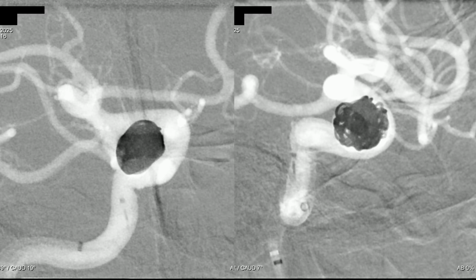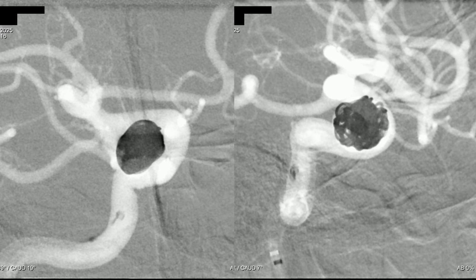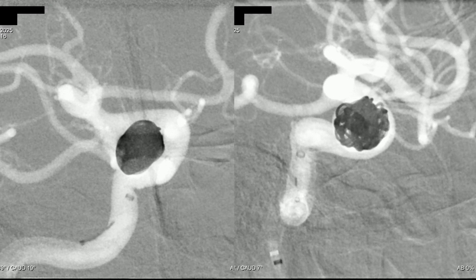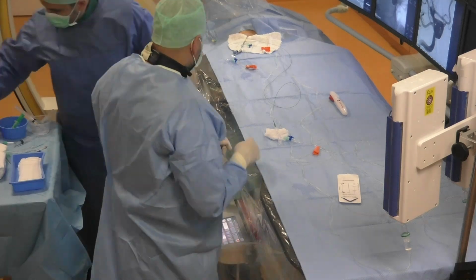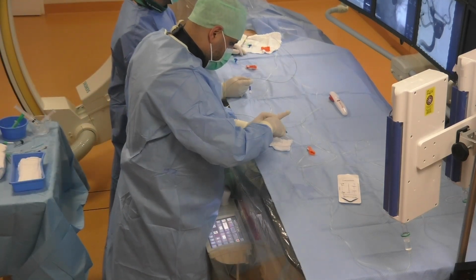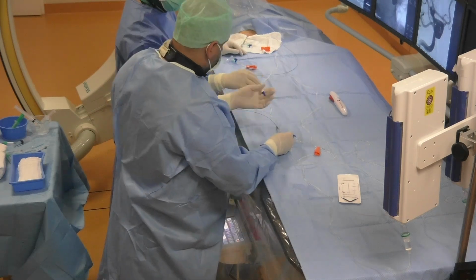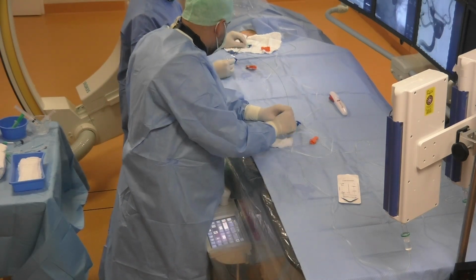And now we can remove the microcatheter with the help of the pusher of the last coil. We do it carefully so we don't dislocate any coils, and now we are outside of the aneurysm, and we can remove the PX Slim microcatheter and take our other microcatheter. It's a Headway 21 by 165 centimeters, which we will use for the flow diverter implantation.